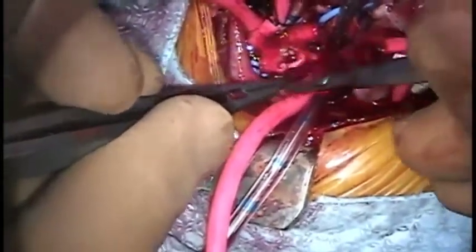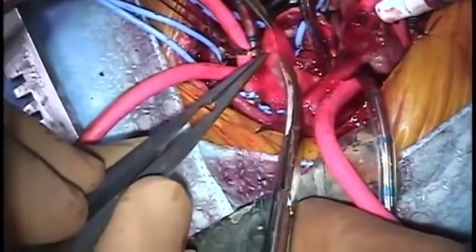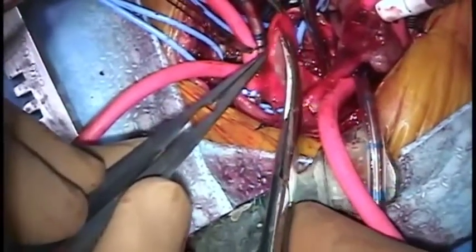Having completed the back wall of the anastomosis, it became clear that for the patch augmentation to sit properly and to match the diameter of the ascending neo-aorta, the aortic arch incision required extension for the full length of the arch.